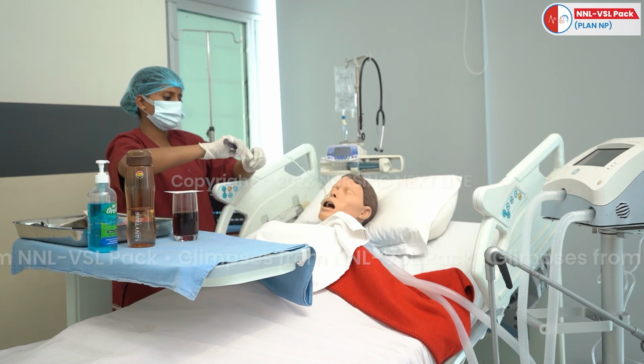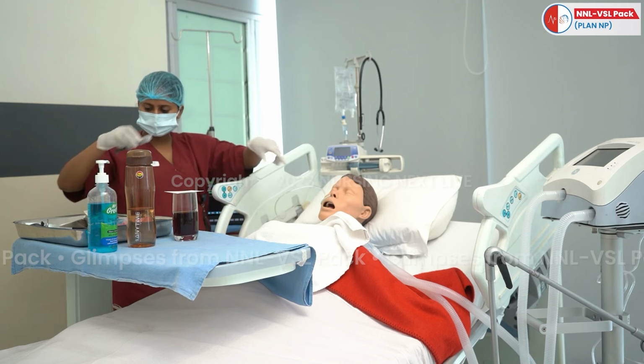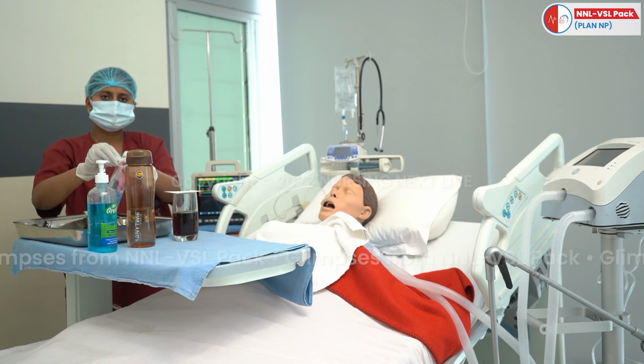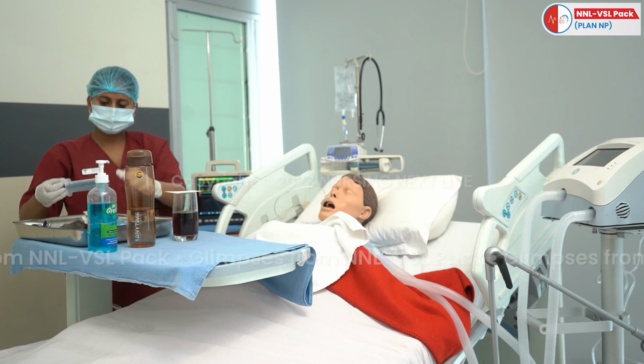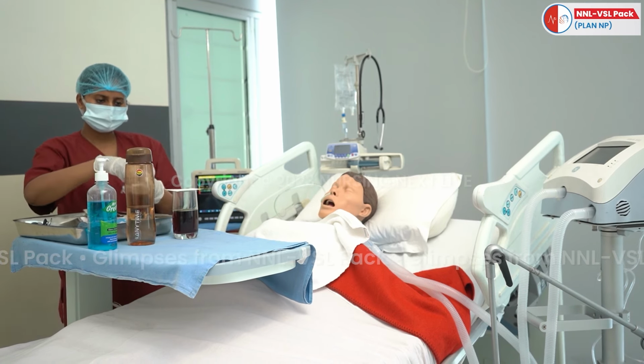Third, aspiration. Check the aspirated content. If it is more than 30 ml, then hold the feeding and inform the doctor. Check the color and amount of aspirated content. Discard it and later record it in the intake-output chart.